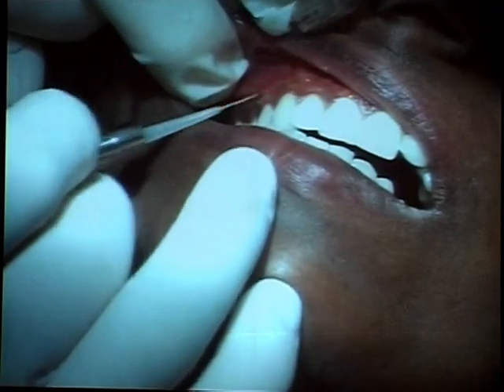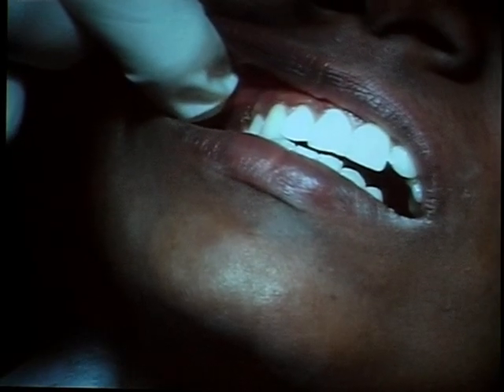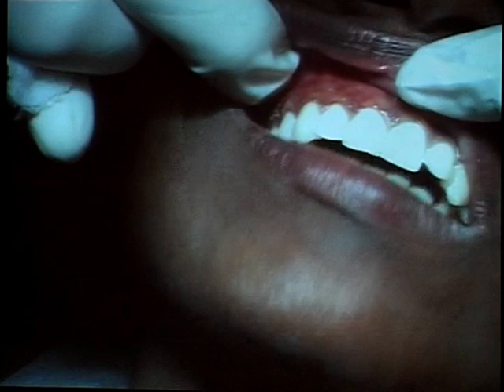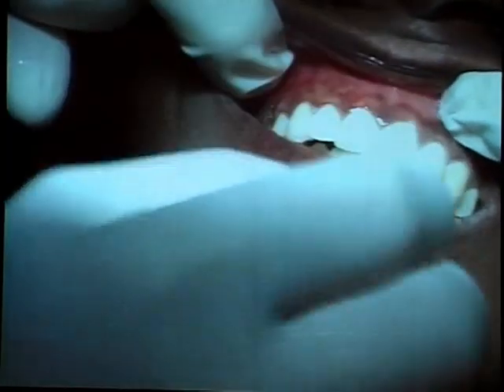And last but not the least, do not promise the patient that it's gone for good, because it will come back. The question is, how fast does it come back? In one patient, I did it two or three times, by the time the patient was satisfied. Apart from the gingival display, the thing that this patient kept telling me was, but doctor, between the teeth it's still visible. Because that's the part which is immediately visible at the smile line.